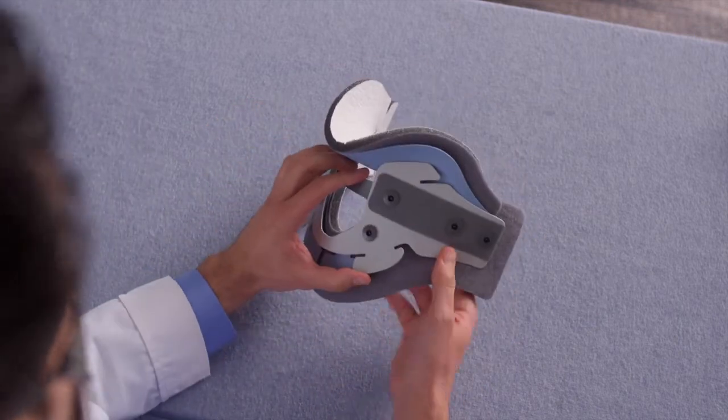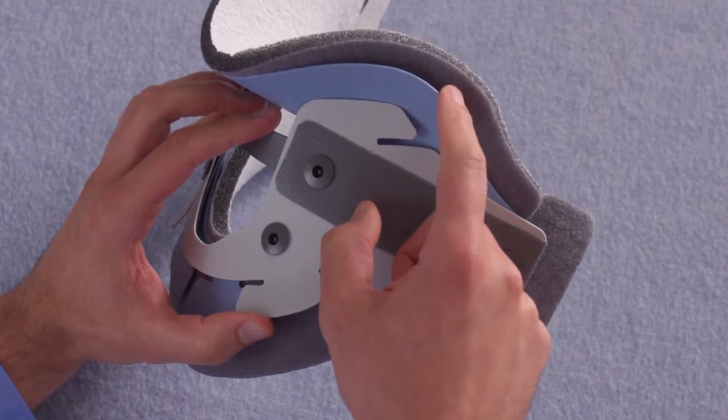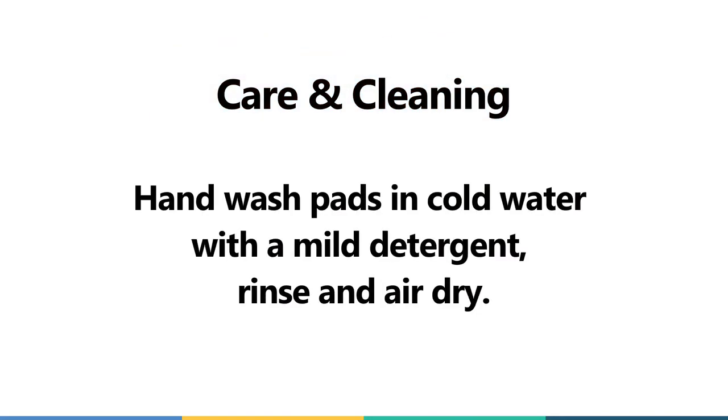When done, you should have the pad approximately one-half inch or one centimeter longer than the plastic panel. Hand wash pads in cold water with a mild detergent. Rinse and air dry.